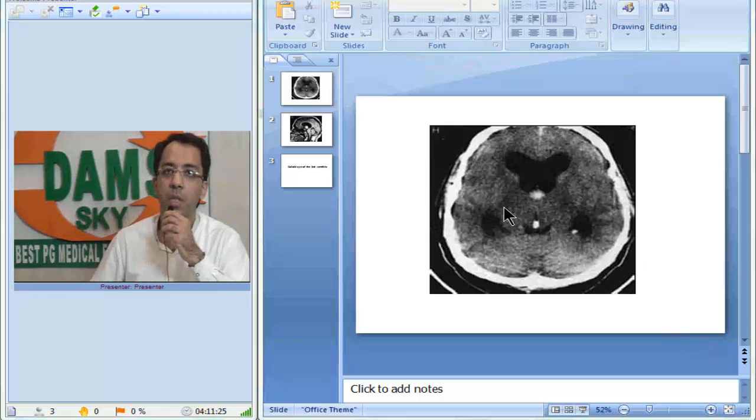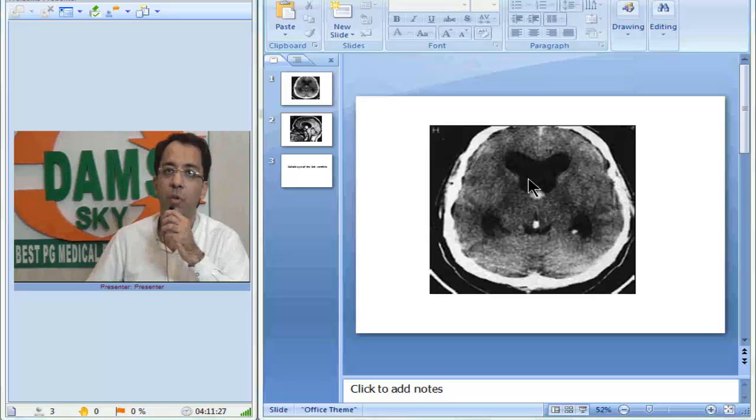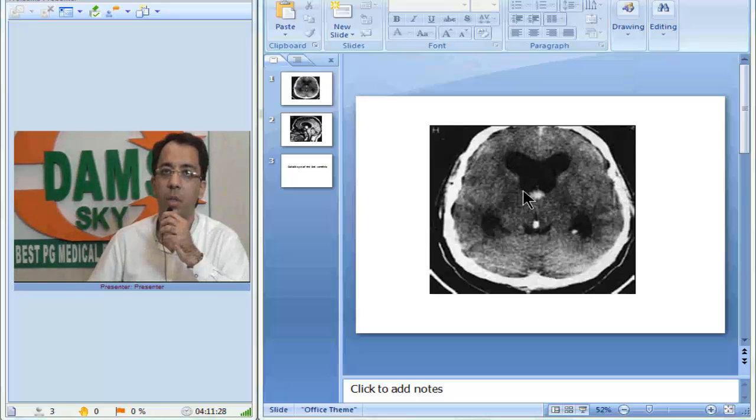What do we appreciate in the CT image? If you look at this, the frontal horns appear ballooned out, they look dilated.